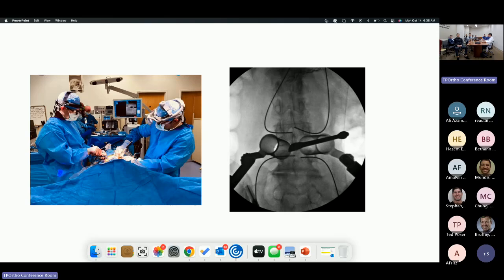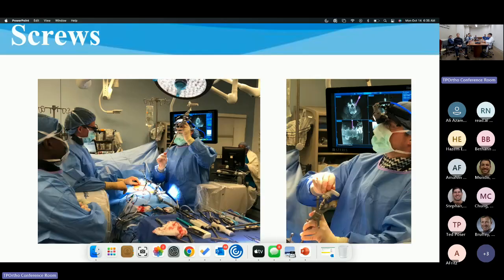This is a picture of that case I did with Ryan where we did it on both sides. So in that case, we didn't put in any pedicle screws. We just cannulated them all, bent them out of the way, dropped our tubes, and having the navigation, even for the decompression, is really nice. Even if all of your instruments aren't navigated, it's just kind of nice to know where you are. But again, I've moved towards trying to navigate the entire procedure.